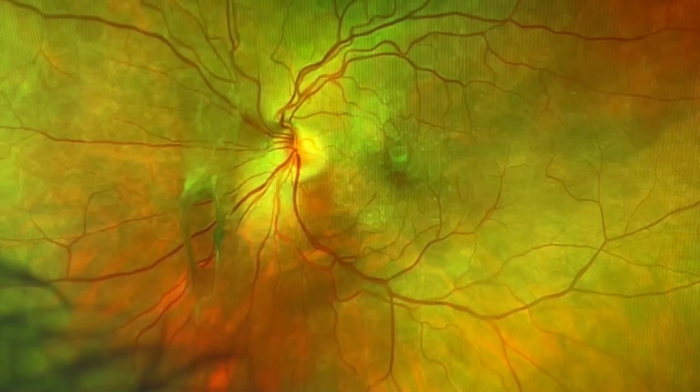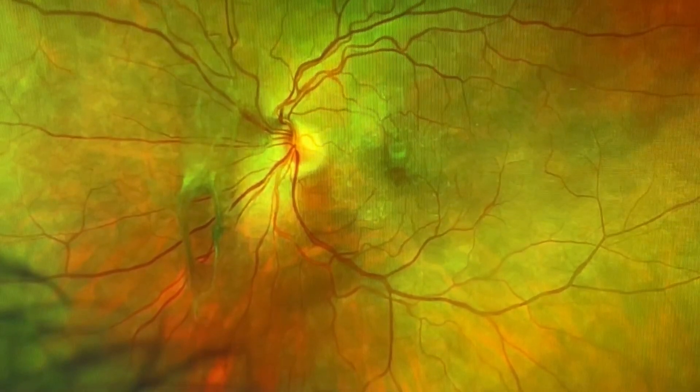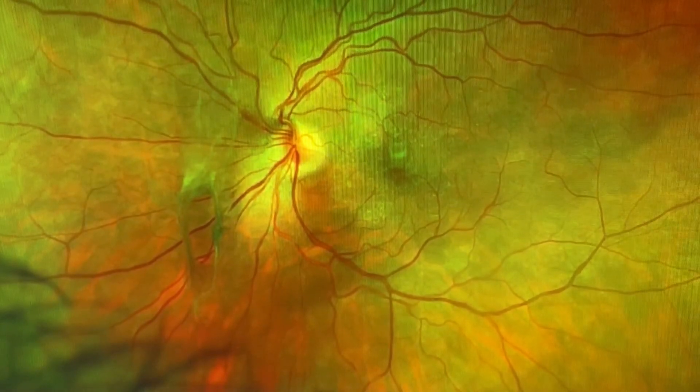This is a patient who has a very pronounced vitreous floater which we call a Weiss ring. Again, the vitreous is the jelly in the back of the eye.